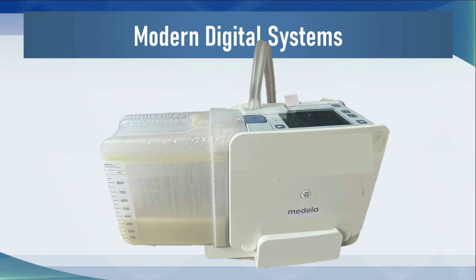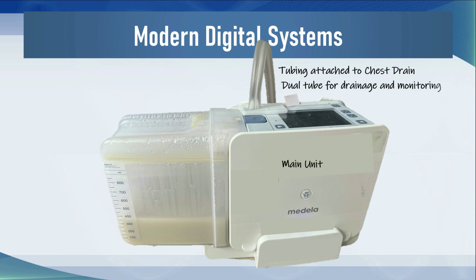This is a modern digital system. It's known as the Topaz Plus. It's going to simplify your management of chest drainage well into the future. Let's go through what this thing does. It has a main unit. It has tubing that is attached to the chest drain, and it's a dual tube. One is for drainage, one is for monitoring. It has a display and a drainage bottle. In this case, the drainage bottle will fill up to 800 mils. The stuff that's in the drainage bottle is milky looking.